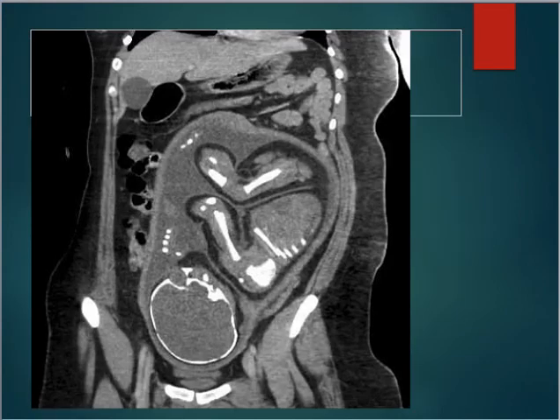This is actually a pregnant female that's scanned on a CT, so obviously you can see the entire sac here that the baby's in. Their skull, the head's down, ready to go. Humerus, scapula, some of their spine and their rib, femur bone, their little fingers here too. I don't exactly know what the reason for this scan was, but you can see here too how much effect it has on the internal organs and how, again, my technical term, they're smushed in different regions to make room for the baby.